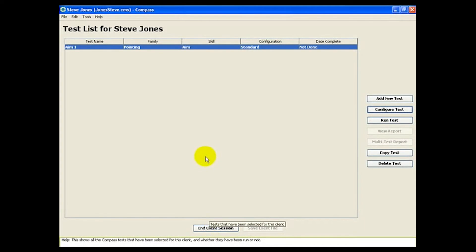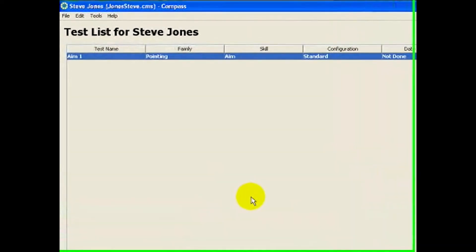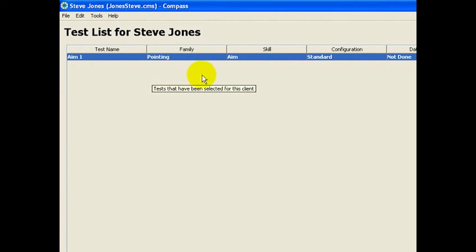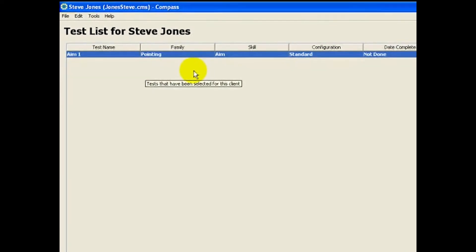This test list shows all the Compass tests that we've stored for Steve. So far, it just shows the single aim test, which is not yet completed.